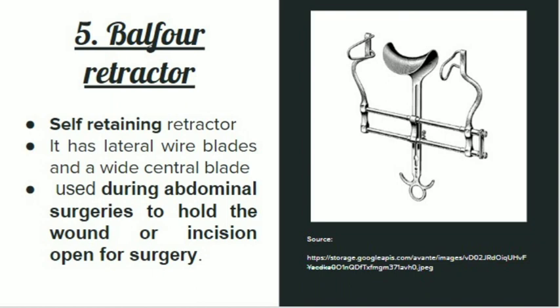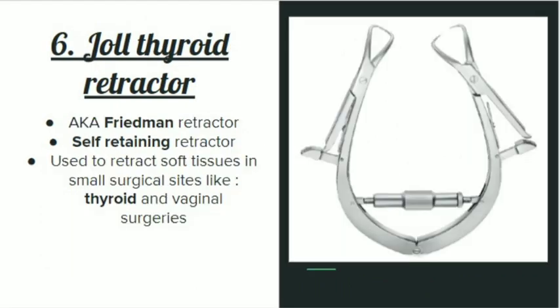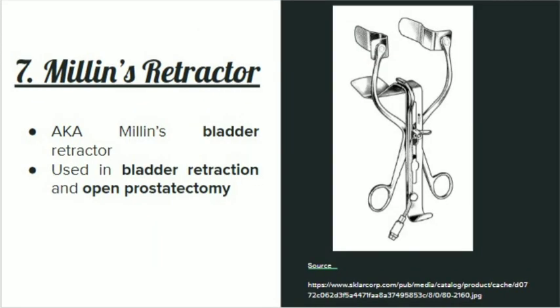The next retractor is Joll's thyroid retractor, also known as the Friedman retractor. It is a self-retaining retractor — as you can see, it has a system of screws in the center. It is used to retract soft tissues in small surgical sites like thyroid and vaginal surgeries.